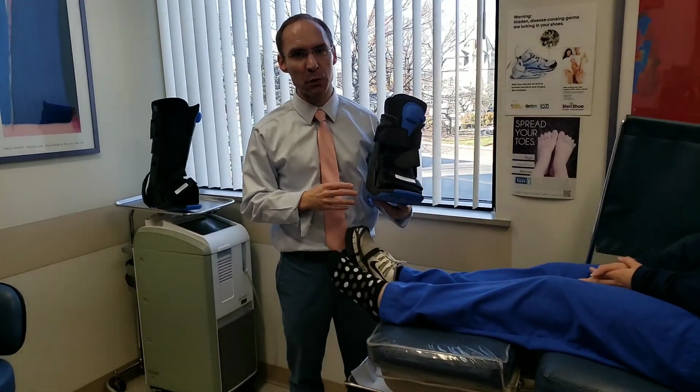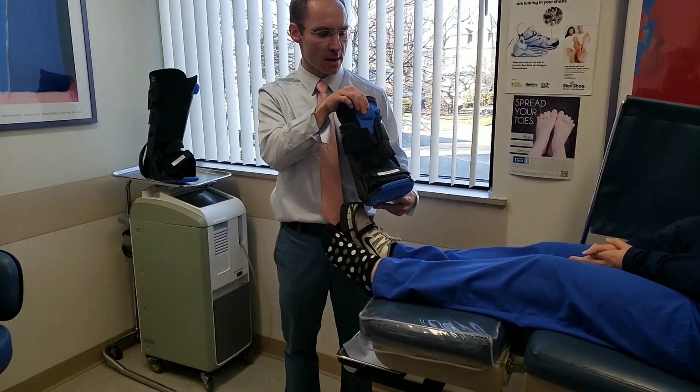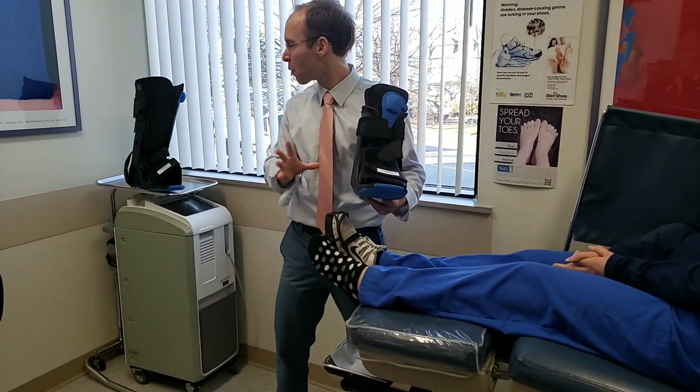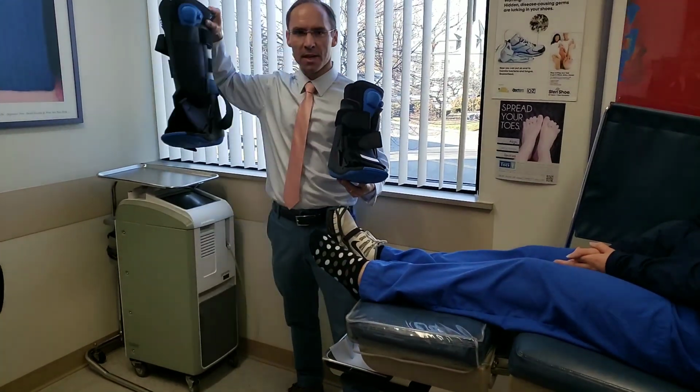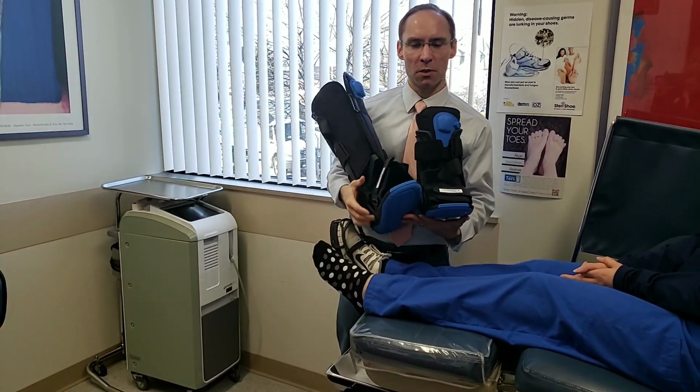These are called a cam boot or a walking boot. This is a pneumatic one, meaning it has a little pump, like the one you used to see in the Nike shoes, and it's going to pump this up and give it more support. That's a short one, and here is a long one. So we'll start to talk about when you would use each of these.